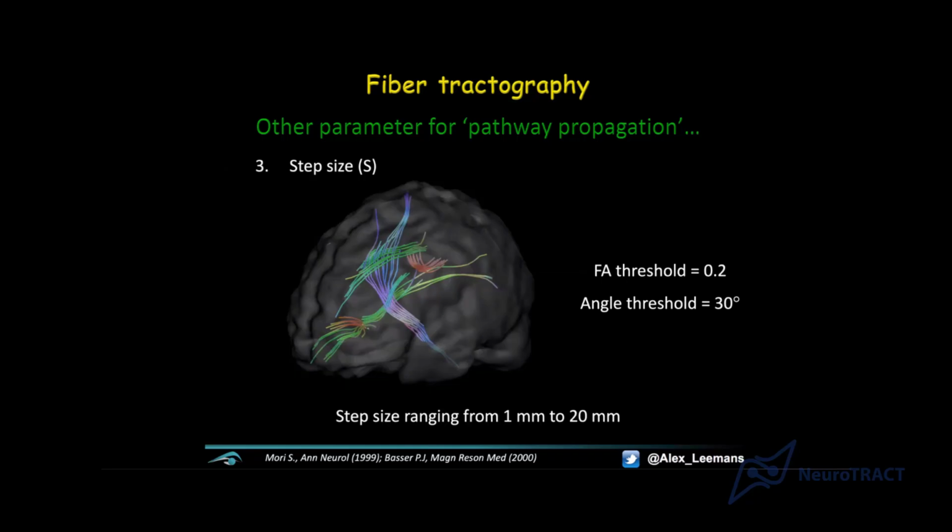And so this is something that we can modify at the acquisition level, meaning that, think of it, it's like a setting on your camera, and you say high resolution, low resolution. Same with an MRI system. You can define what is the resolution that I want in my data. But again, trade-off is the name of the game.